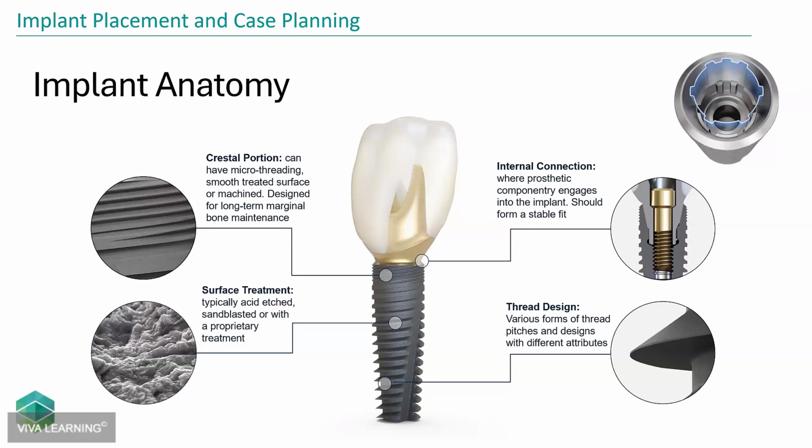So again, I'm not sure how much everybody knows about dental implants, so we're just going to start right from the basics of the implant in general. An implant is a replacement for a tooth root, and it goes into the bone. The bone heals around it, and what we do on top of it can have various options. So a typical implant, and even though we're talking about Biotech tonight, I'm going to use a lot of different examples. I do use Biotech. I think it's a great implant.